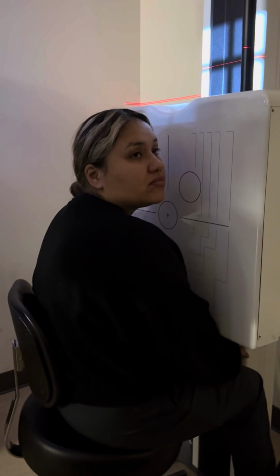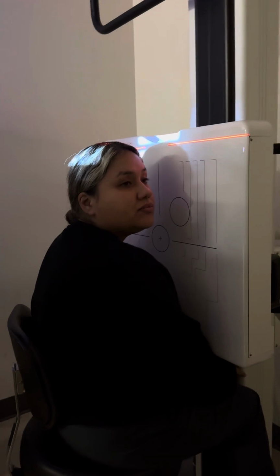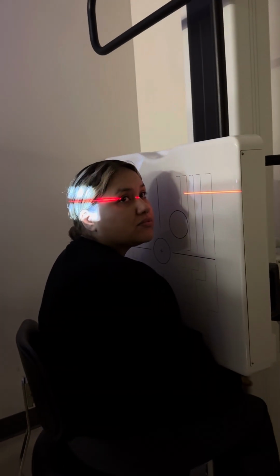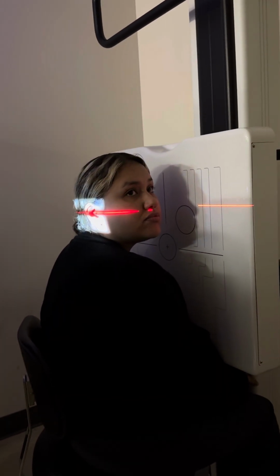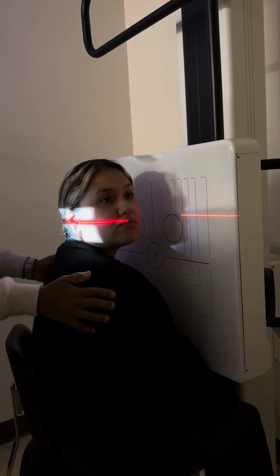Yep. This is actually the lateral for facial bones, so we would want to be right there in the zygomatic arch. You're right, this is the zygomatic arch. It's between the EAM and the outer canthus, so somewhere between those two, along this bone here, which we call the zygomatic arch.